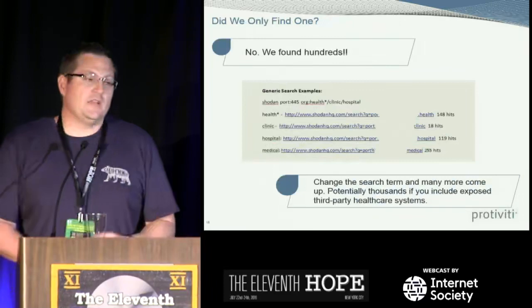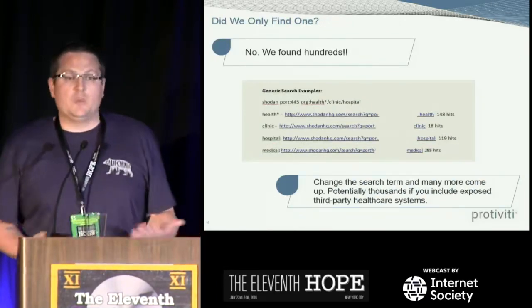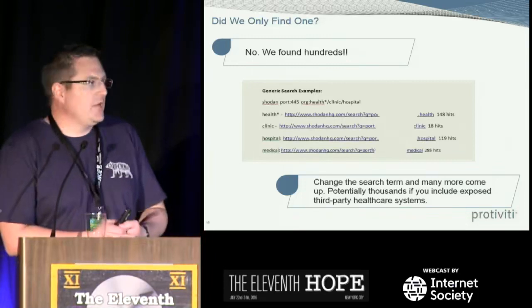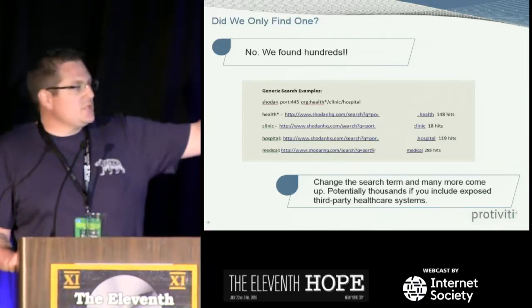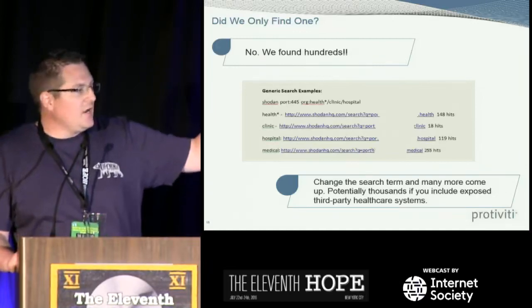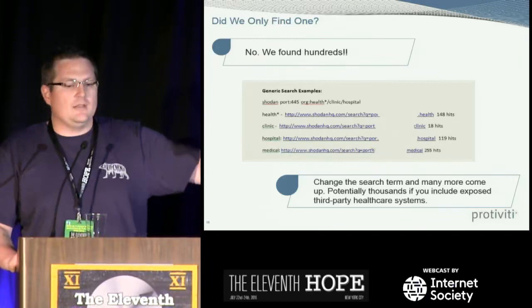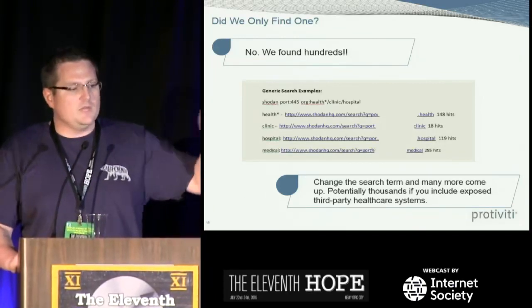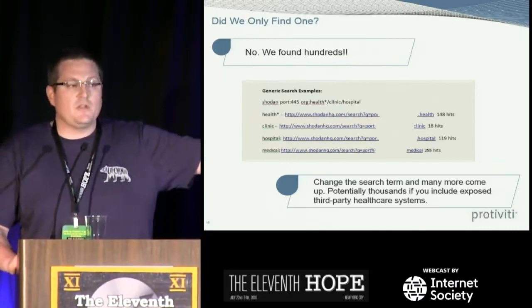So did we just find and just happen to come across one big massive problem? No, we didn't. We took that search in Shodan and looked at the organization names, and we did these quick searches, as you can see, for health or clinic or hospital or medical that would indicate it's a healthcare facility, and also had a misconfigured system with SMB that was leaking information about their medical devices. Those were the returns. Very quickly we found hundreds.